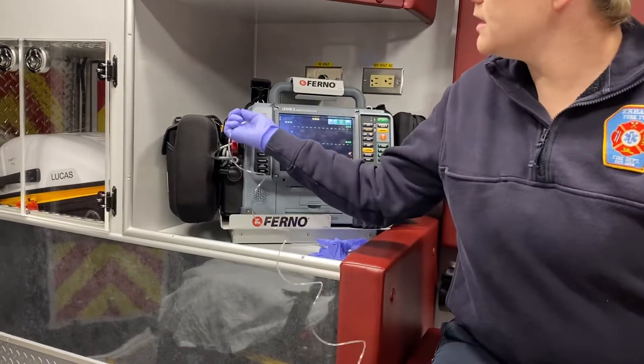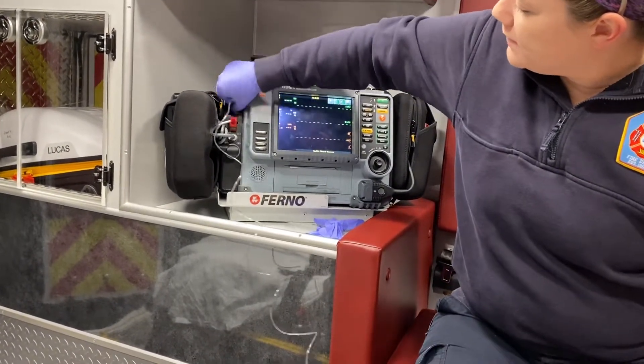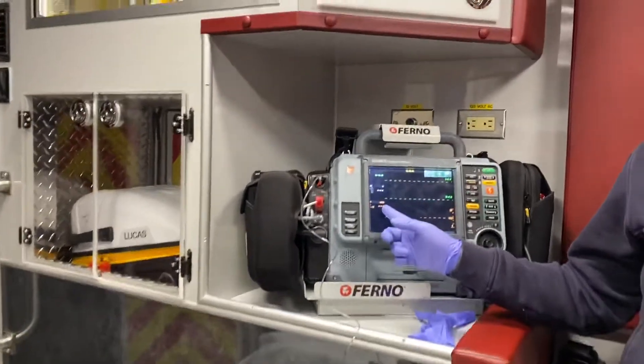Then you want to put in your waveform capnography before you put this on your patient, because it does need to calibrate. It goes into your capnography port and just twists in like a key. Give it a couple of seconds to read on your monitor so it calibrates without any air going into it.